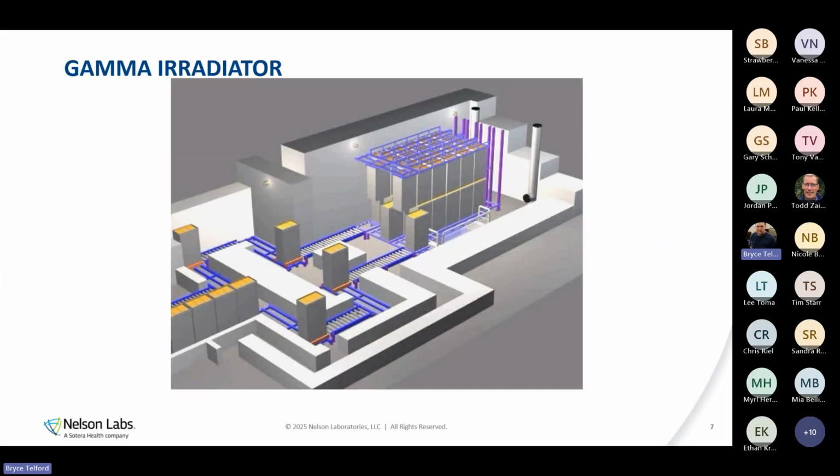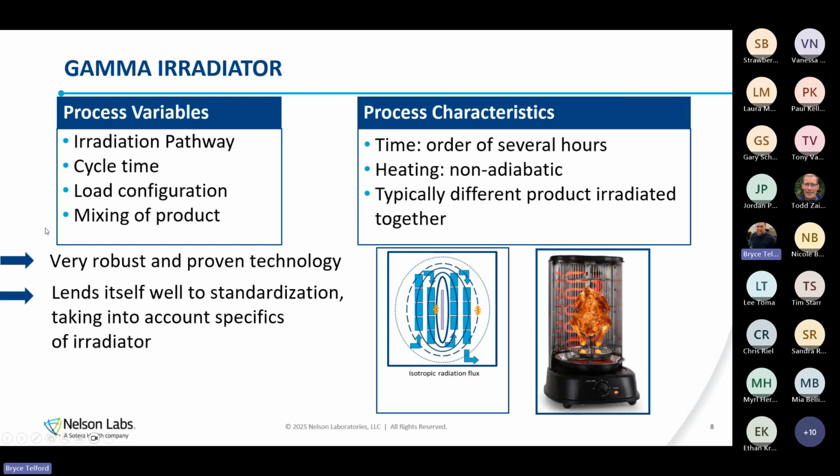If we go back to our video, the carrier that we are using might be followed by a completely different company's carrier in what they're using. So we do have some variability in that we have mixed product going through, and we also have the option to send mixed product through ourselves. Depending on our dose map, we may be able to send more than one type of product through the irradiator so that we can maximize what we're loading into our carrier, because generally speaking, for gamma, we're paying on a per carrier basis.